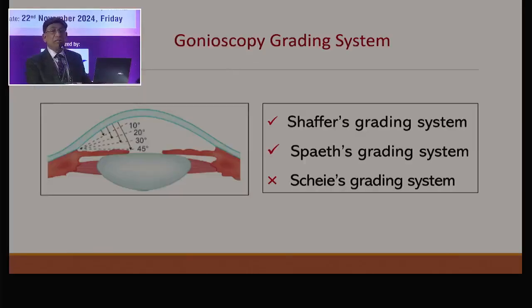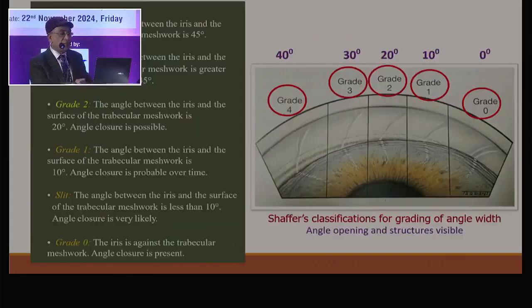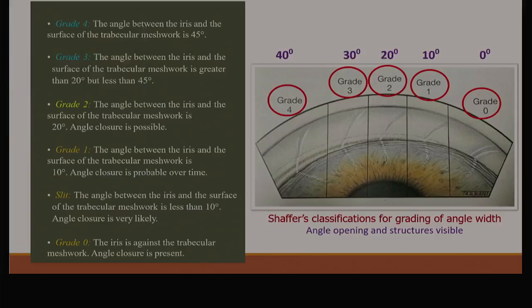Now coming to the grading, there are different ways of grading, but the most important is Shaffer's grading. Sometimes we also use the Spaeth grading. For remembering, I will say that if you can see all the four structures, the grade is 4, 40 degrees.